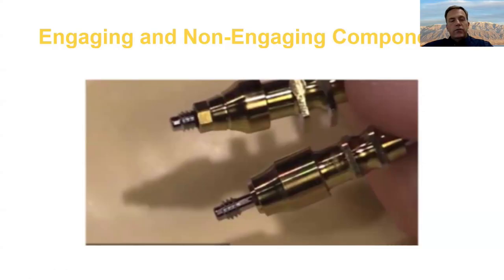And some of the newer studies, well, they're not newer anymore, but in this century at least, have talked about how, let's say you've got 3 implants you're joining together under a crown and bridge case. Historically, we would have done 3 non-engaging parts. Some of the finite element analysis studies show that having an engaging component on the first one, the most anterior, and non-engaging on the other 2, gives even more optimal stability. So that's something you can consider in your practice.